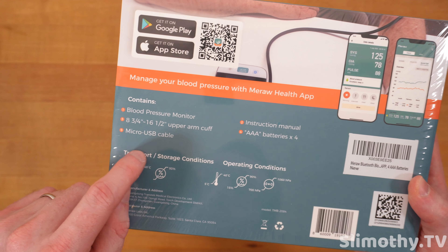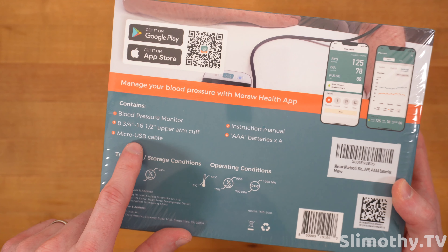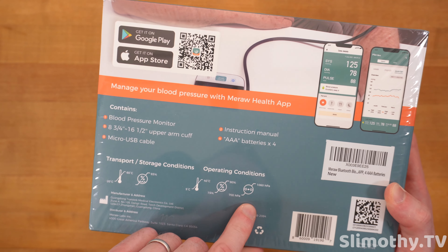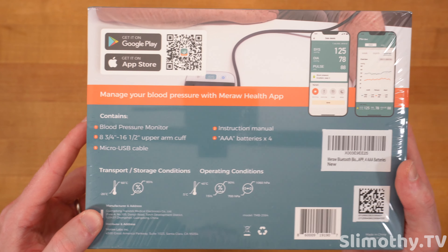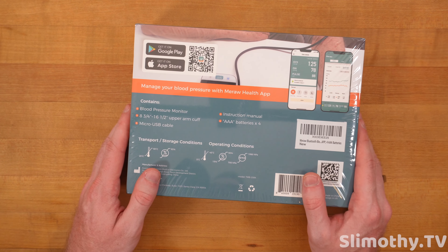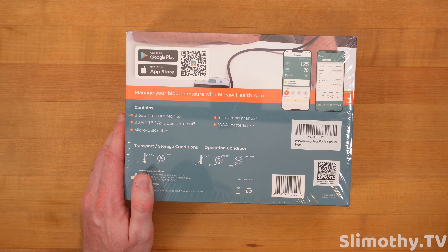Taking a look around the box, here's what it contains: blood pressure monitor, upper arm cuff, micro USB cable — that should be USB-C, it's 2024 — instruction manual, and four triple-A batteries. Here are the operating conditions and here is what the app looks like, but we're going to explore all of that in this video.